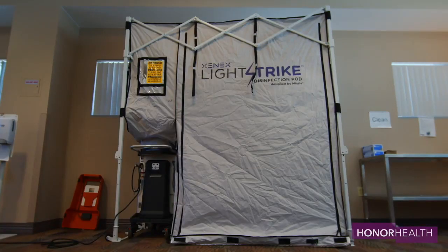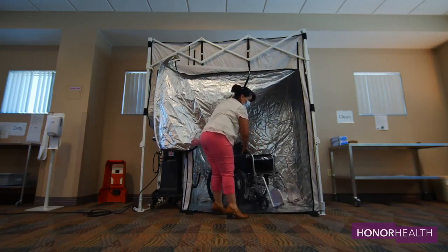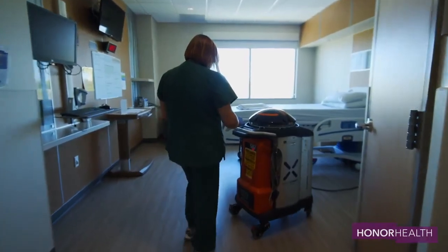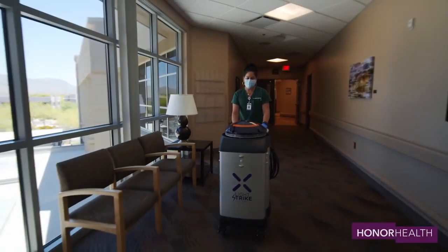The robots are used throughout the hospitals, but especially in areas where COVID-19 and high-risk patients are treated. The hospitals also use the same technology found in these robots to sanitize mobile equipment like wheelchairs, gurneys, and IV poles.